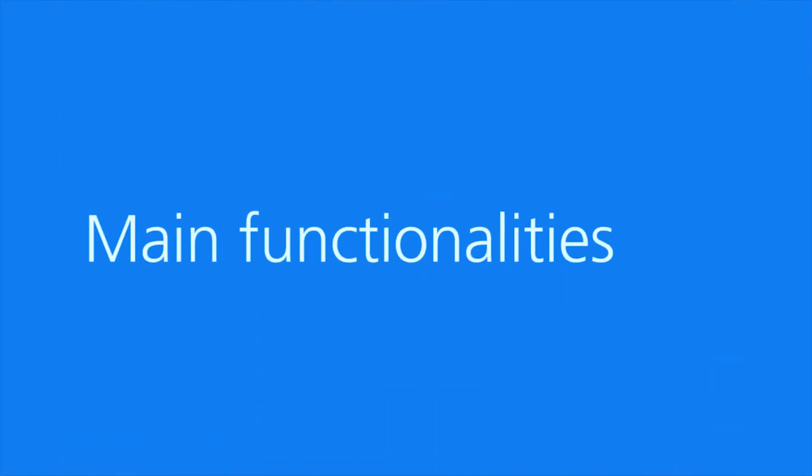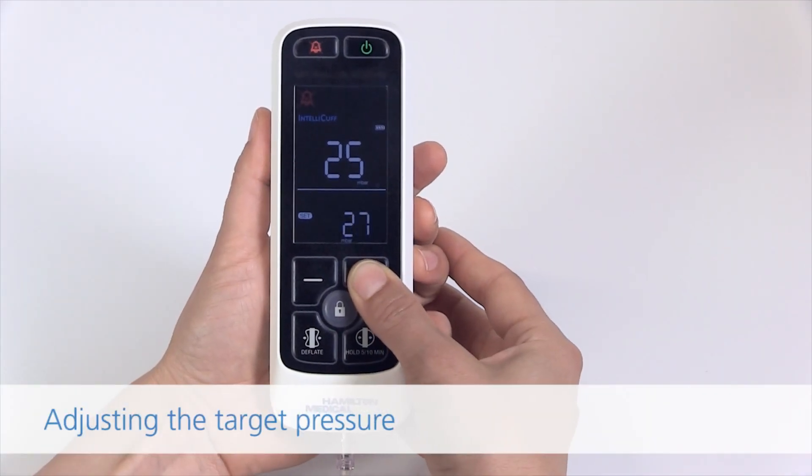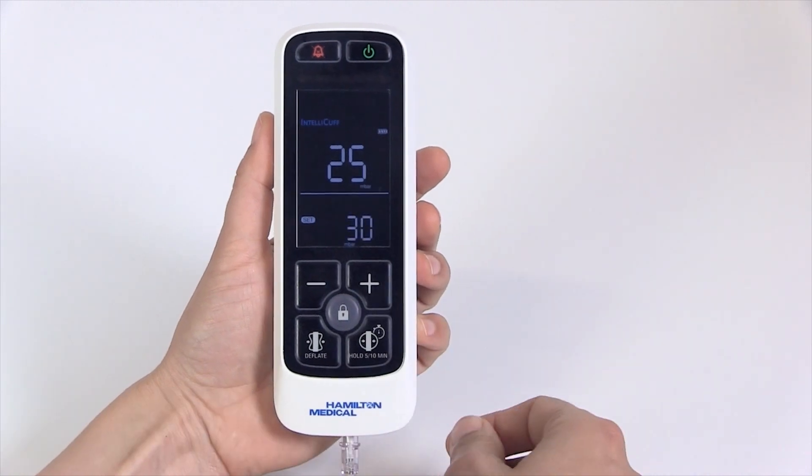Main functionalities. Adjusting the target pressure: press the increase or decrease button to adjust the target pressure.